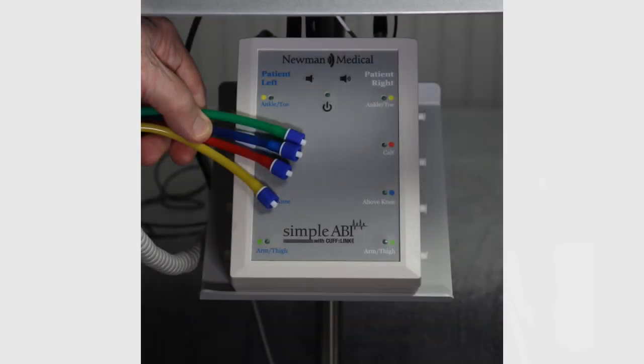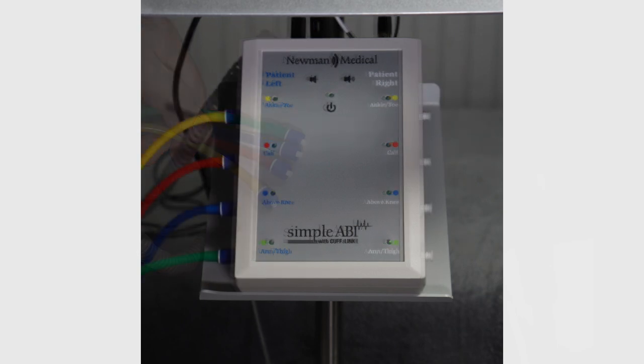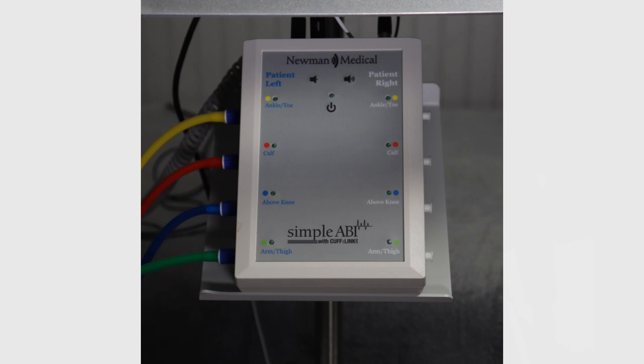Locate the blue connector hoses for the left side of the cufflink ports. Connect the patient's left blue connector hoses to corresponding cufflink ports.